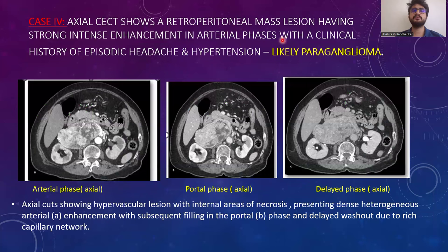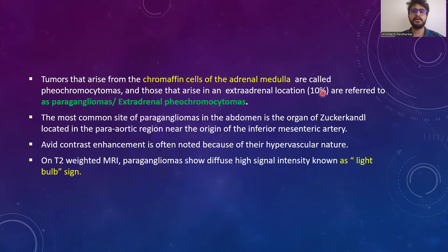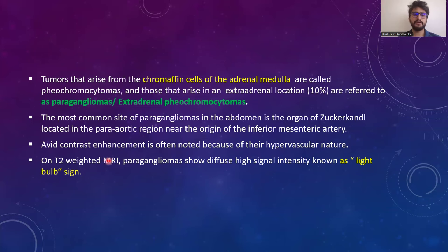Case 4: Axial CECT shows a retroperitoneal mass lesion with strong intense enhancement in arterial phases, with a clinical history of episodic headache and hypertension — likely a case of paraganglioma. The hypervascular lesion has internal areas of necrosis, showing dense heterogeneous arterial enhancement with subsequent filling in the portal phase and delayed washout. Tumors arising from chromaffin cells of the adrenal medulla are called pheochromocytomas, while those in extra-adrenal locations are paragangliomas. The most common abdominal site is the organ of Zuckerkandl, near the origin of the inferior mesenteric artery. On T2-weighted MRI, paragangliomas show diffuse high signal intensity known as the light bulb sign.